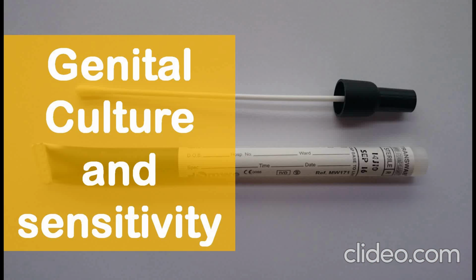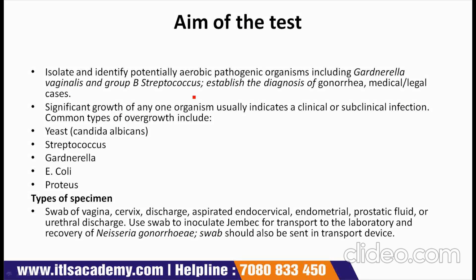Our lecture is Genital Culture and Sensitivity Test. First of all, we will see the aim of the test, or why the genital culture test is performed.